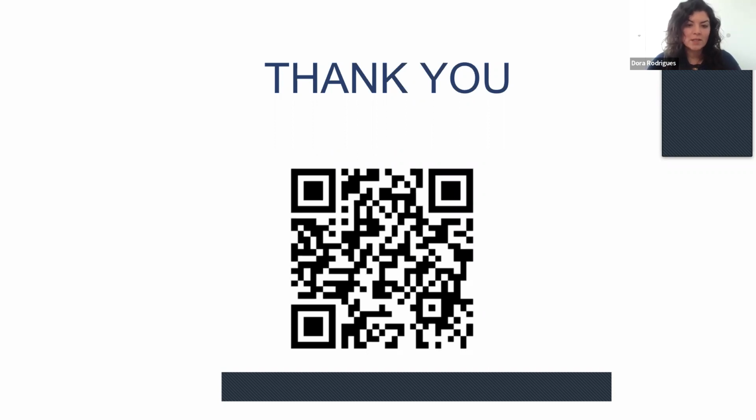So once Flexera Smile Ultra Plus came out, I followed a couple of doctors and a couple of people that had been using the resin for a long time. It's not like, okay, let me buy this and I'm going to use it. I have trust issues, so it takes me a long time to trust a product. I followed a lot of people using different brands, and I ended up getting that one because that's what I felt more confident with. And I have no problems at all.